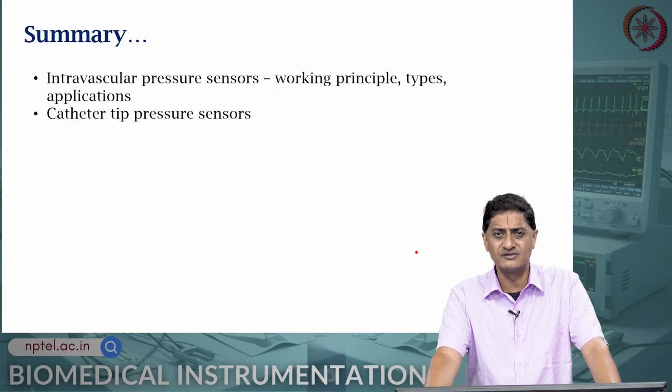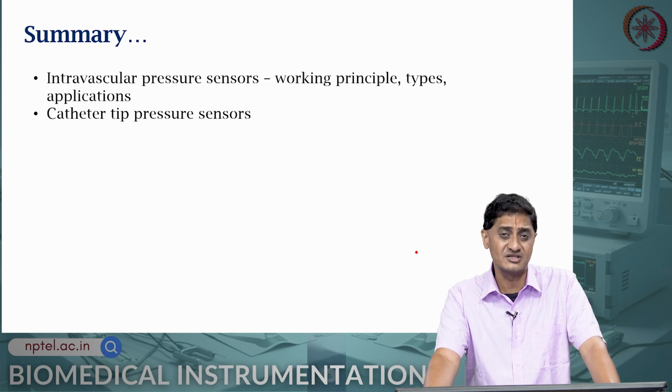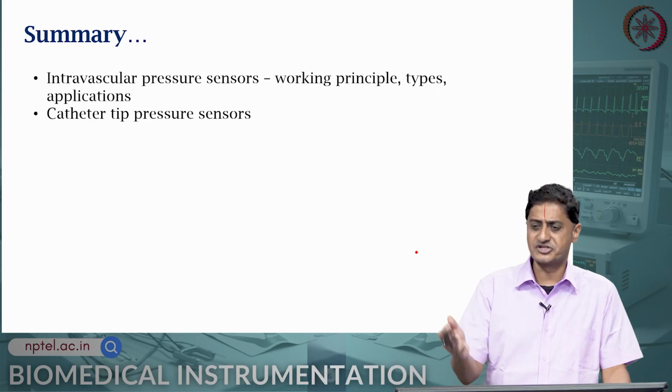A couple of disadvantages: shear forces it will have to withstand, and biofouling can affect its performance. And it is more expensive and it requires more recalibration. The advantages are already very well known, I have mentioned many times.